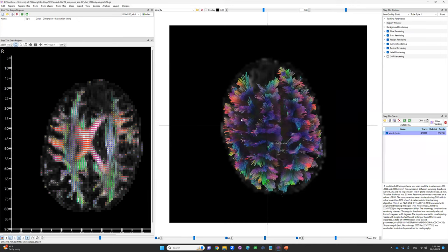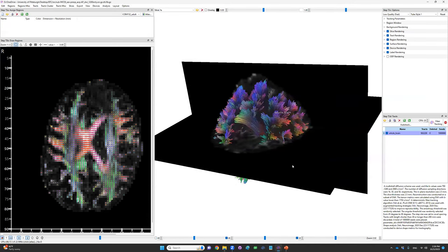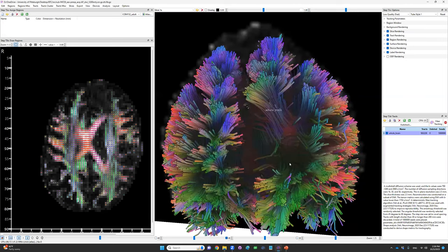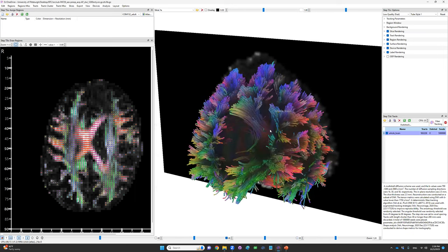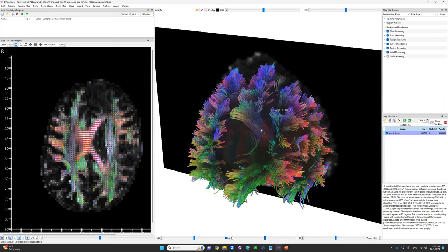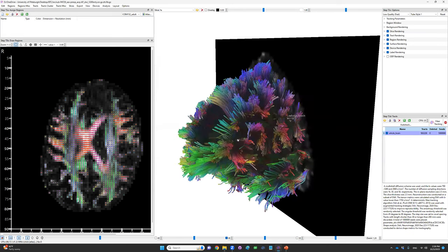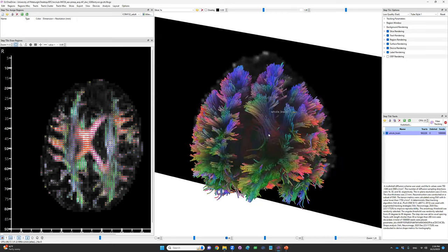This may give you an impression that the tumor may have been destroyed. And taking the fiber tracking, DTI tractography will show similar information. The tumor will destroy a large region of the fiber. If you're a neurosurgeon, you may think this tumor already destroyed a lot of fibers and take a larger resection, hoping that this would reduce the remission rate.